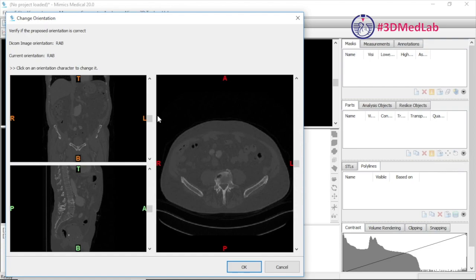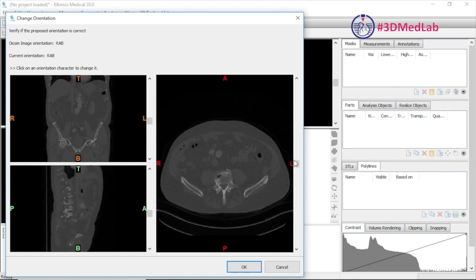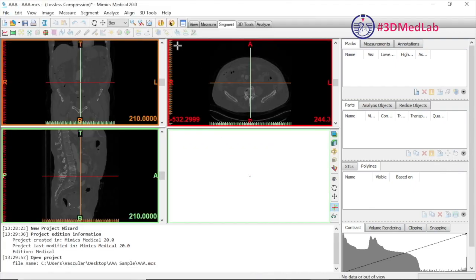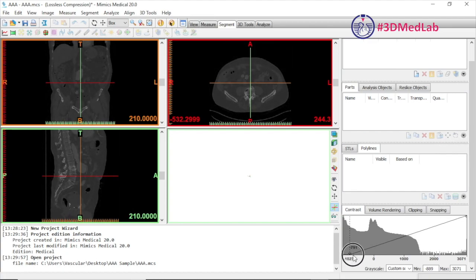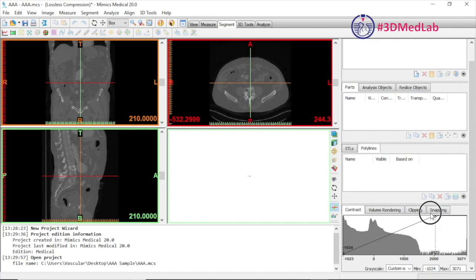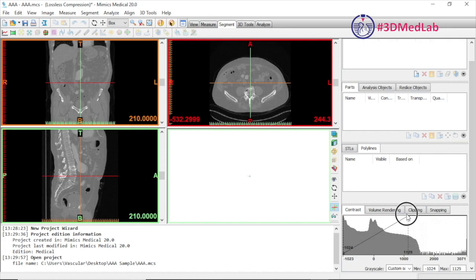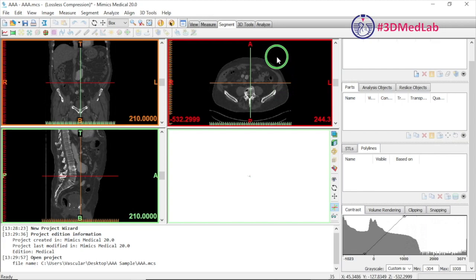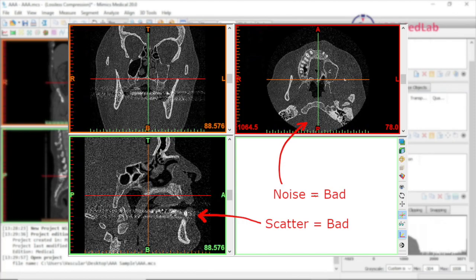Always double-check that you've got the series that you want — Mimics gives you a chance to do this and also to check your orientation markers. This is a good time to adjust your windowing; you can do this manually via the histogram bar or using the right-click-and-drag method. You'll notice here we've chosen a CT scan that's been soft-edge filtered. If you have a hard-edge filtered acquisition, you may find it's not suitable for segmentation due to scattering artifact.